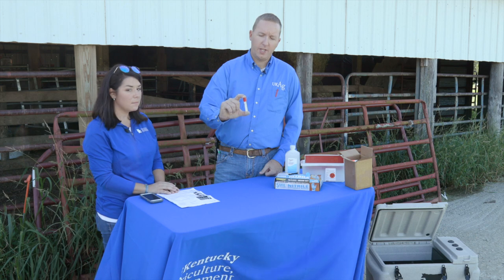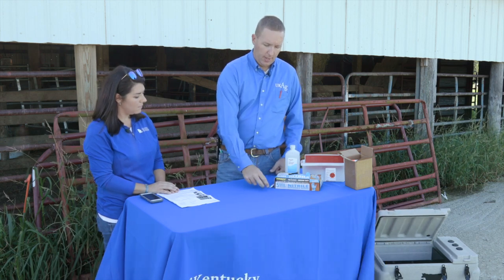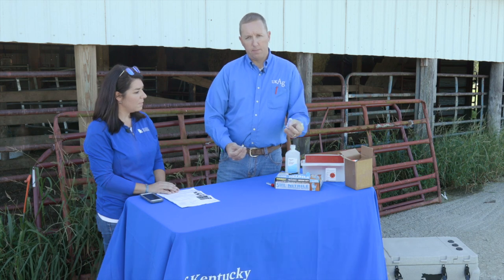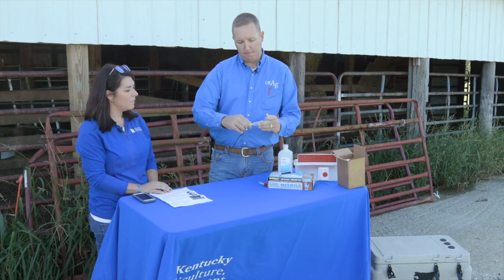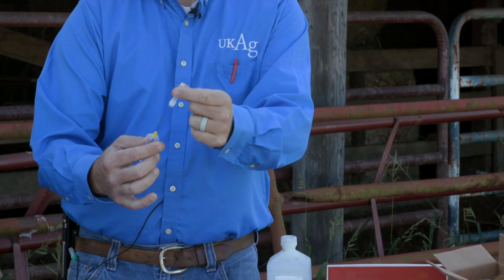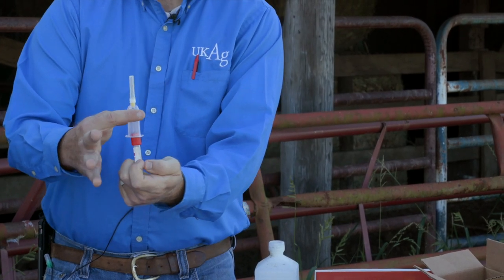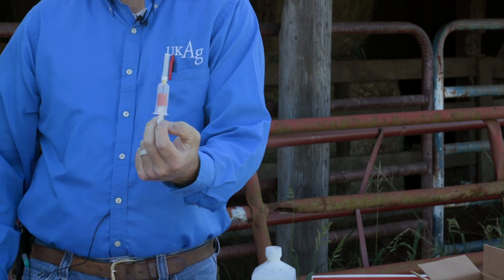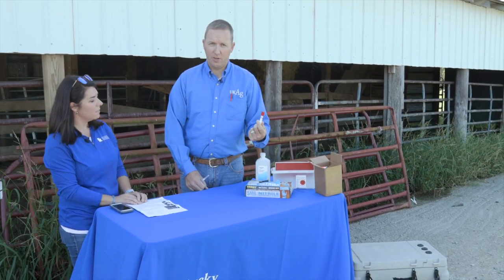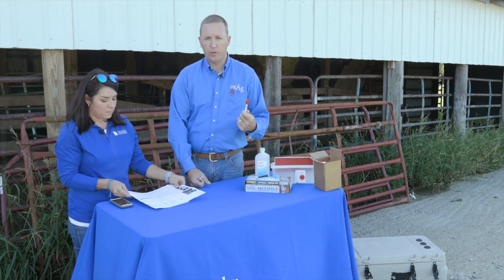These are red-top blood tubes that are vacuum sealed — there's a vacuum inside that draws the blood. Any time we puncture the tube we release that vacuum, so we keep the tube intact until we're ready. We insert the needle into the vein first, and once we're confident we're in the vein, we apply the tube through the holder and pierce the vacuum. We're looking for about 3 cc's; the tube has a red line at the 3 cc mark. If a cow bleeds slowly, we can remove the top and collect manually.